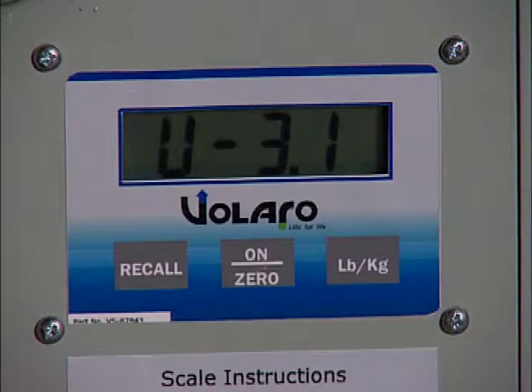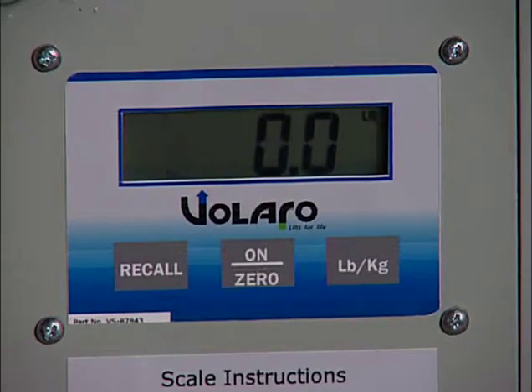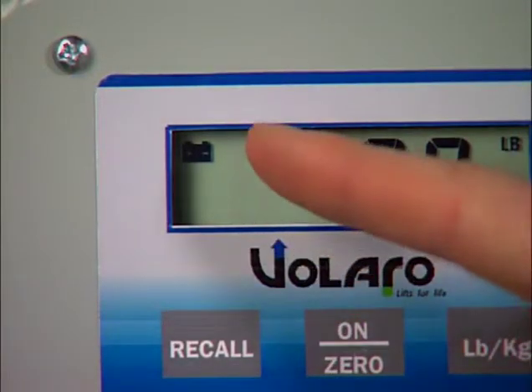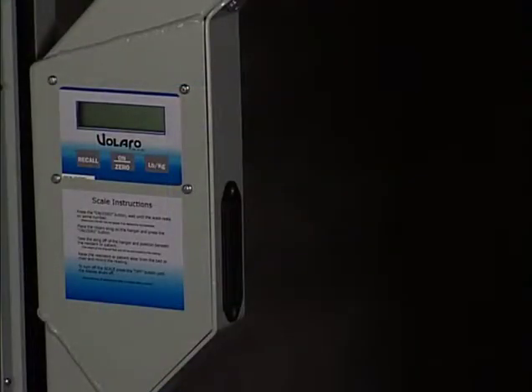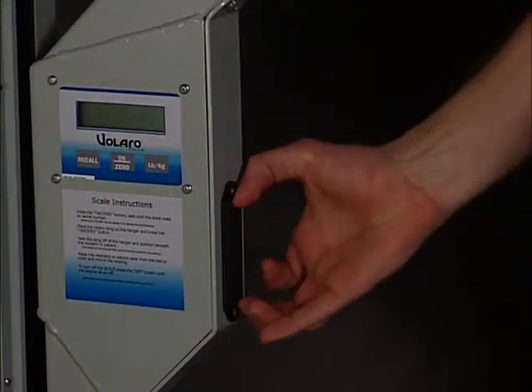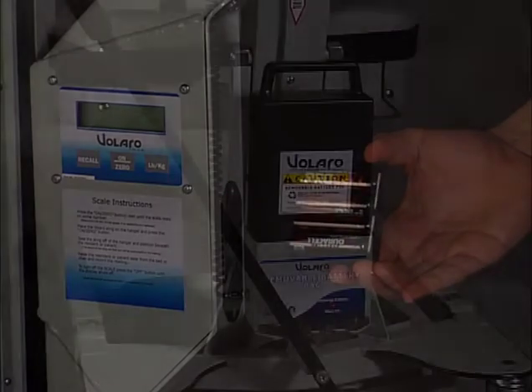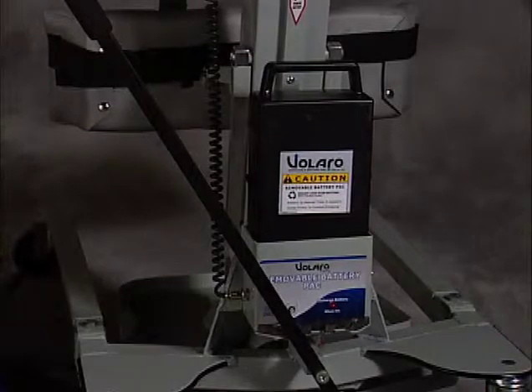Turn on the scale by pressing and releasing the On Zero button. After the scale runs through its start-up process, view the display and make sure that the Low Bat symbol does not appear. If it does, it means the scale batteries are low and should be replaced. The Series 4 lift scale operates on four AA batteries located in the front of the scale box, while the Series 4 stand scale operates off the power of the main lift battery.